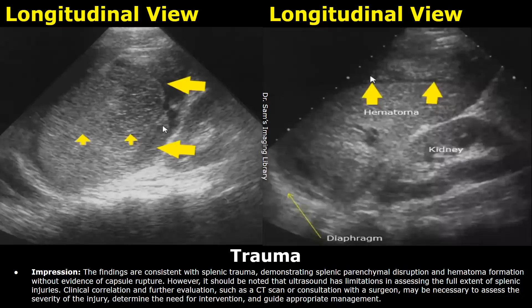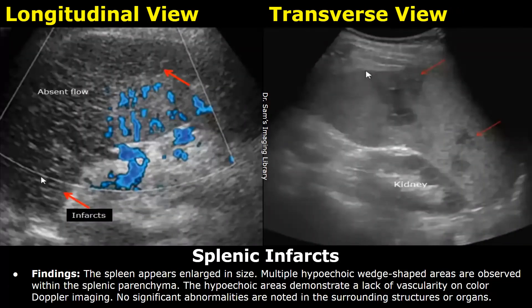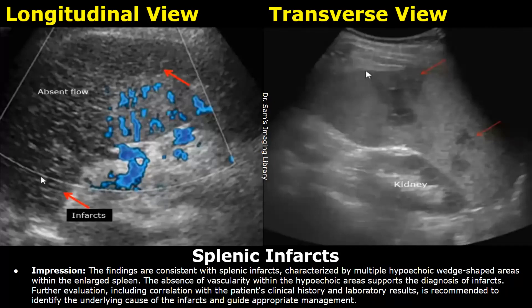Here is a case of splenic infarcts. In the findings, multiple hypoechoic wedge-shaped areas are seen. The hypoechoic areas demonstrate a lack of vascularity on color Doppler imaging. In the impression, you can mention the multiple hypoechoic wedge-shaped areas as well as absence of vascularity within the hypoechoic areas, which support the diagnosis of infarcts, and then you can write about clinical correlation.